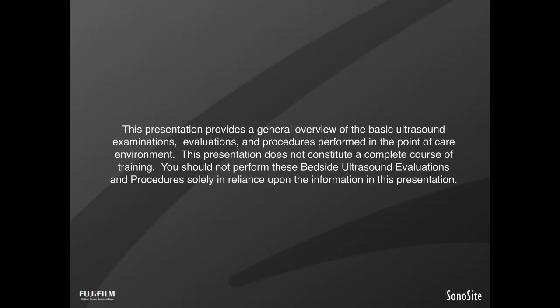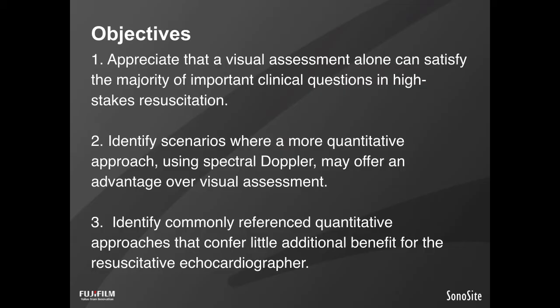And we, of course, have a disclaimer that this presentation represents a lot of my opinion and shouldn't replace good training. And, of course, this is true of anything with a procedural base. You need supervised training in order to become competent. So please, I hope this is thought-provoking, but please put it in the context of your own training environment.